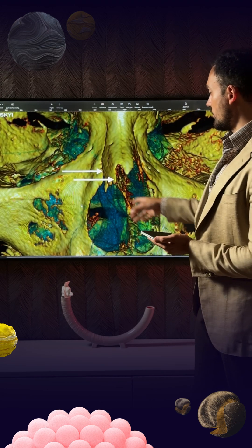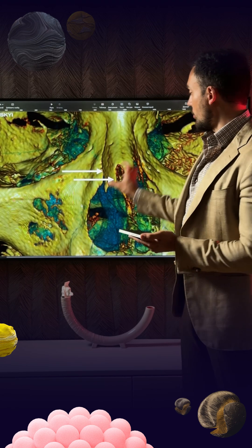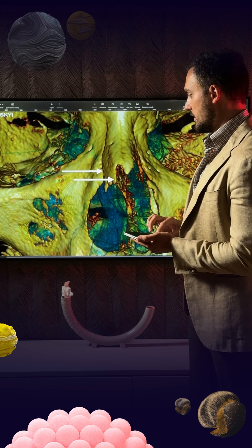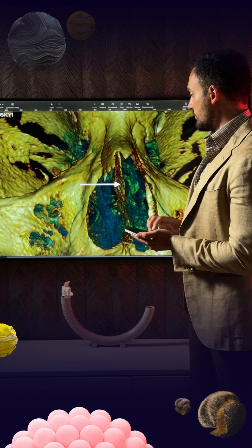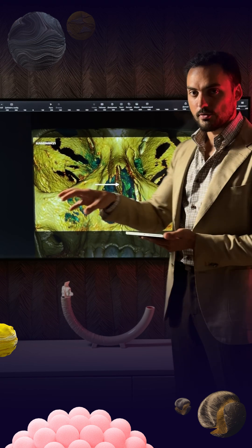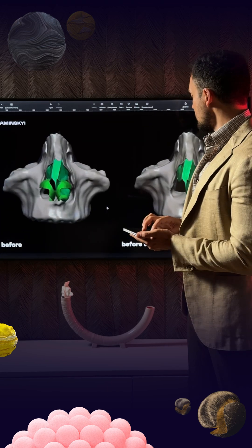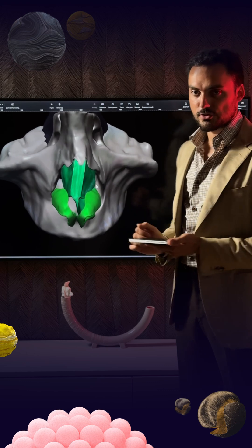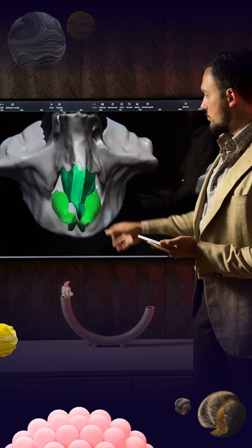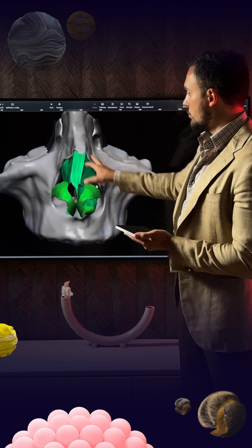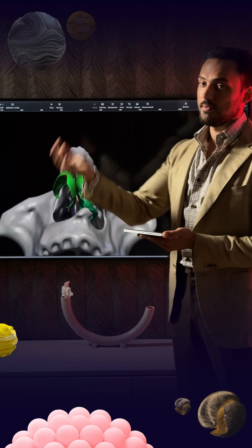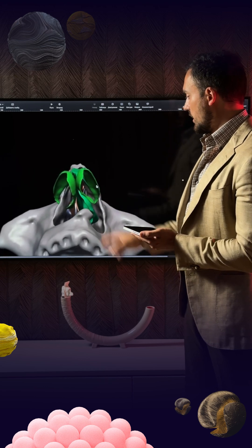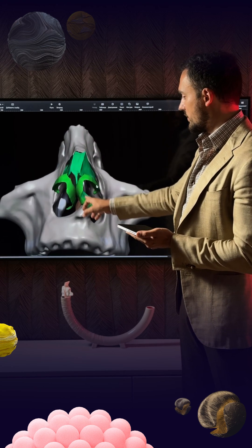So we can see that we have the asymmetry of the bony part of the septum. We have deviation asymmetry of the nasal bones. So I was focused first of all on these asymmetries on the tilted part of the nasal pyramid. And I understood before that I need to correct this bony part of the septum inside. And here is the video of the nose before the surgery. I reconstruct the nose.